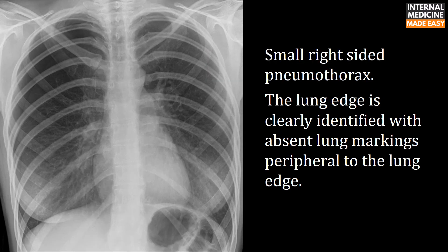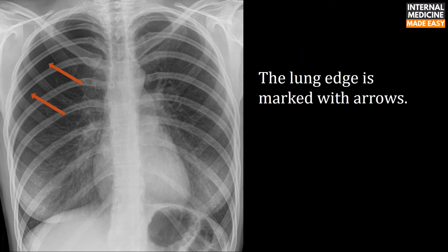This is a small right-sided pneumothorax. The lung edge is clearly identified with absent lung markings peripheral to the lung edge. The lung edge is marked with arrows.